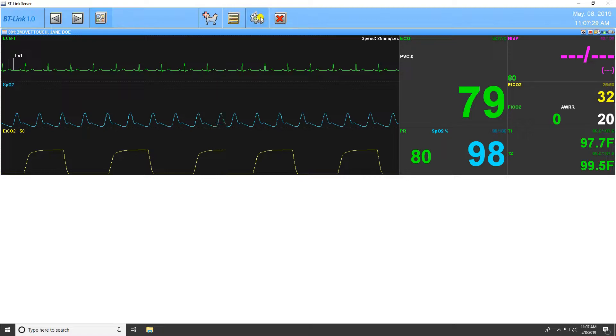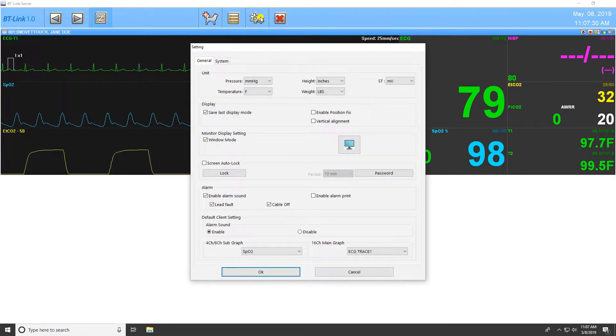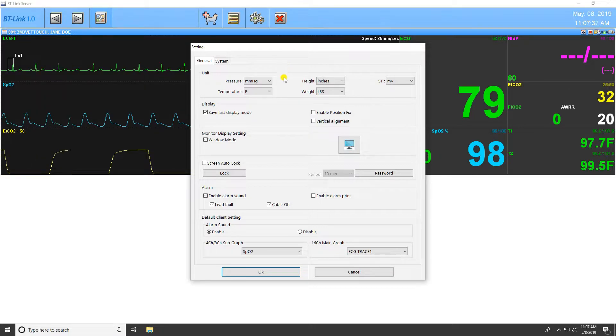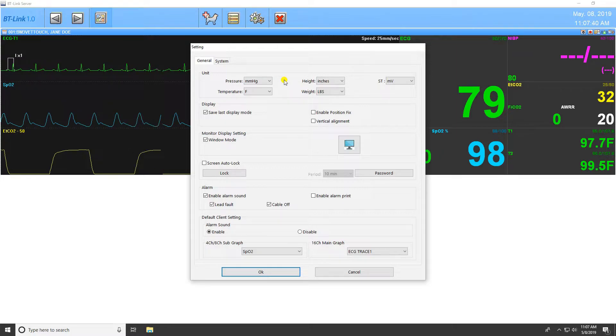Clicking the gear icon will open the Software Settings menu. The first tab in the Settings menu is the General tab. In this window, you will be able to change the display units of measure, such as temperature, weight, and pressure.